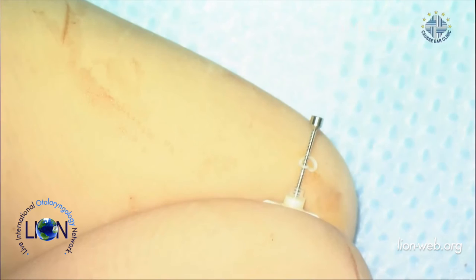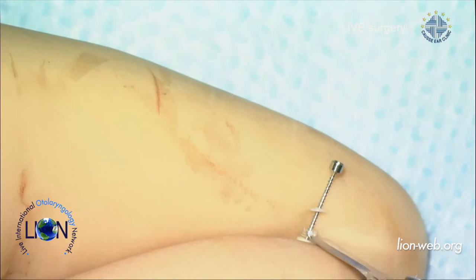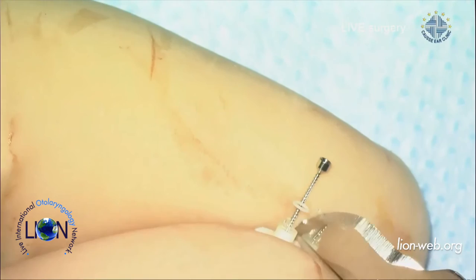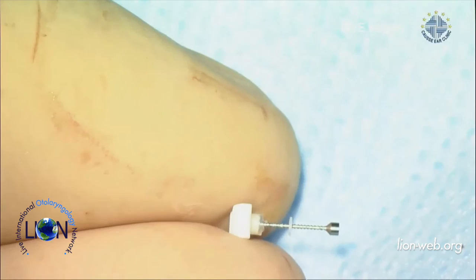So I like to remove this part sometimes. I don't do it all the time, but here I want to make an S shape. So I need to get a little bit longer wire part of the shaft. This again is a detail, but I think that's important. It's this kind of thing that makes the difference if we can. All right, now it's fine. The bend will be like this, and now I'm going to make an S shape.